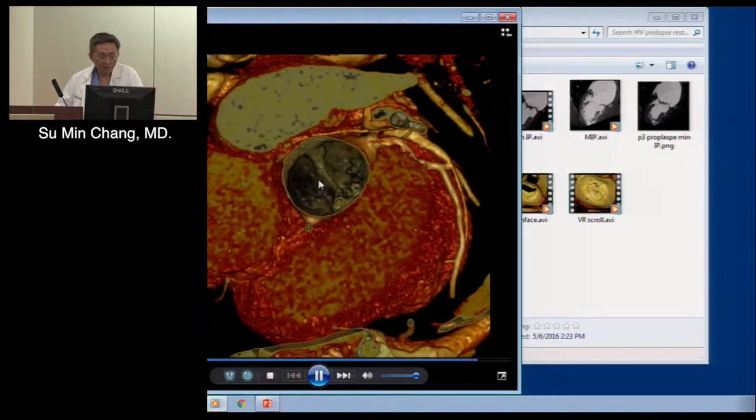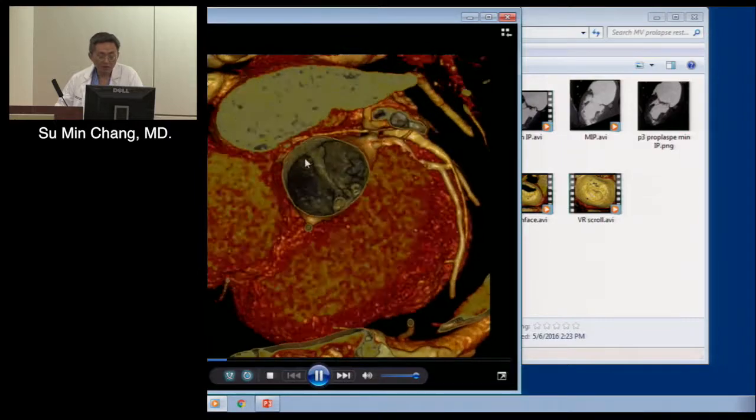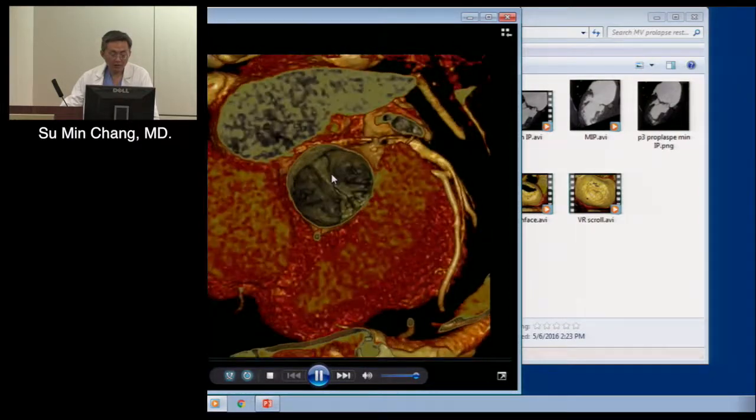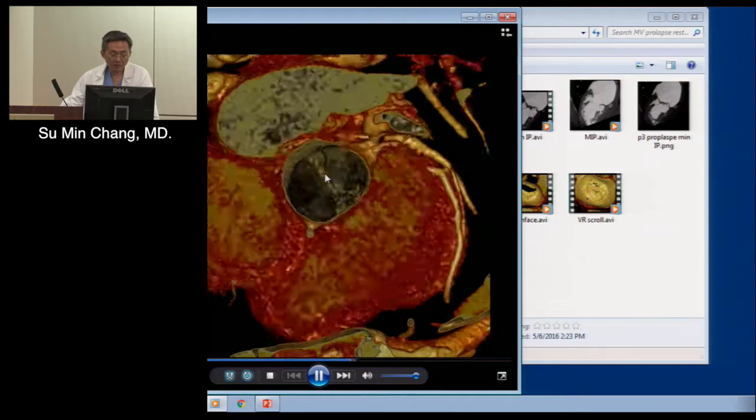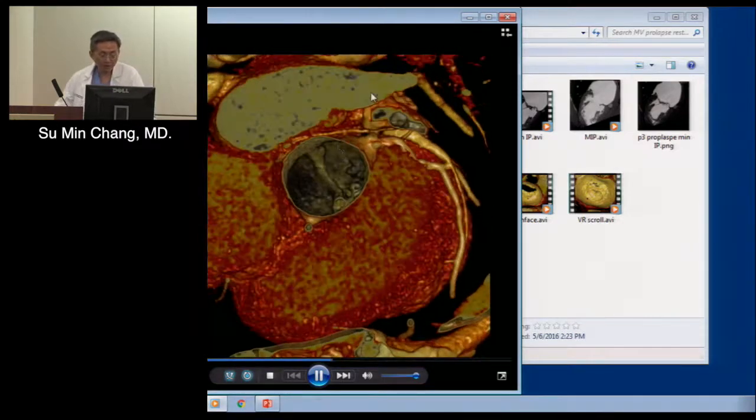So, Bashar, what are you looking at here? What structure is this? Come on, you've done CT? No, no prosthetic here. Yeah, so this is the aortic valve, okay? And you can see very nicely this 3D or 4D display of one patient with bicuspid aortic valve.